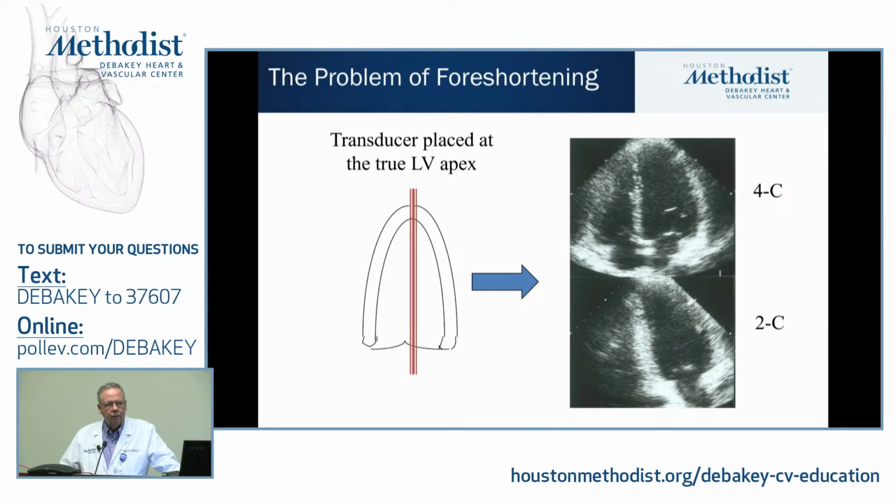But the apex of the LV, and this is important for the sonographers in the room, is not the apical impulse that you feel in a patient. That is more of the distal RV. So that's why you all have been trained to bring the transducer further down once you feel the apical impulse, because as you go further down, you get closer to the apex.